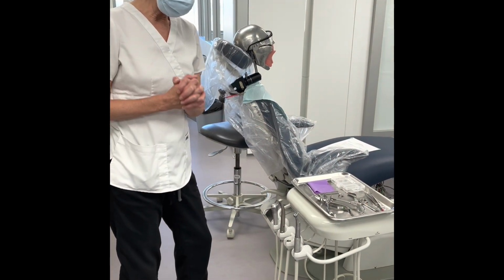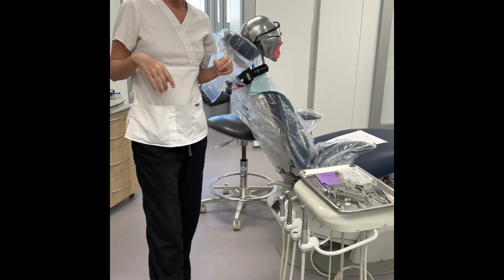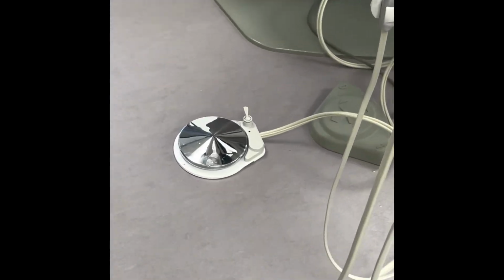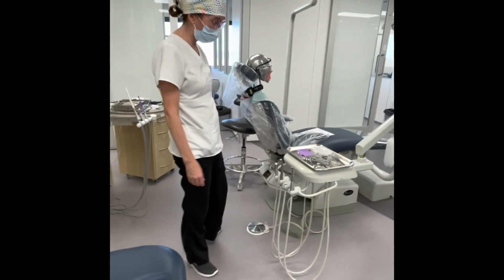All right, so I have my burrs in my hand pieces. When you go to run your hand pieces to make sure that they are operating correctly, make sure that you have the toggle turned on the rheostat, okay? So you see there's a little blue dot there. Make sure you just kick that little toggle over towards that blue dot to ensure that we are able to run water through our hand pieces.